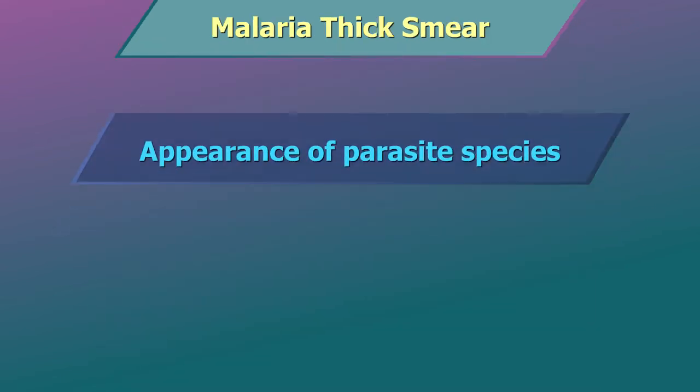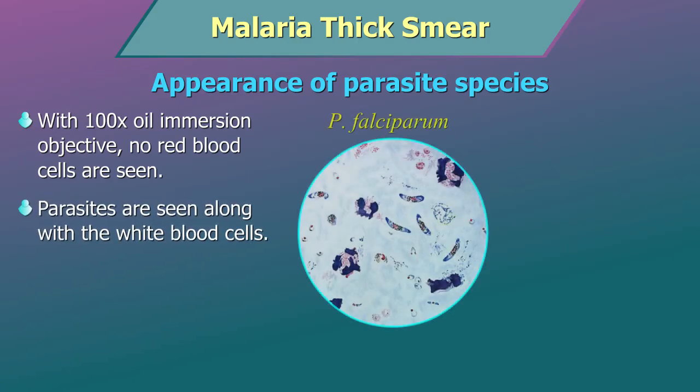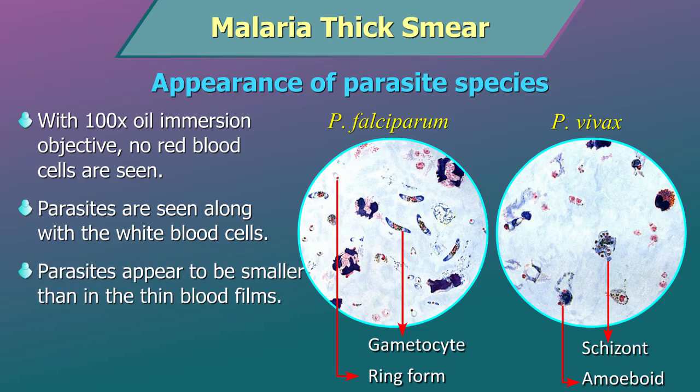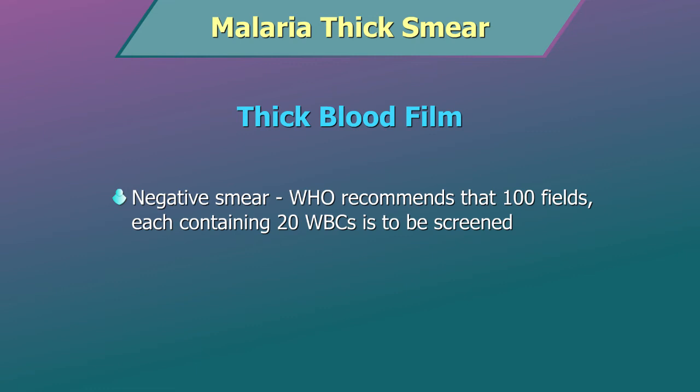Appearance of parasite species: in a thick blood film with 100x oil immersion objective, no red blood cells are seen. The malarial parasites are seen along with the white blood cells. However, the parasites appear to be smaller in the thick film than in the thin blood films. The fine rings of cytoplasm of the trophozoites may appear incomplete or broken in thick blood films. WHO recommends that at least 100 fields, each containing approximately 20 white blood cells, be screened before calling a thick smear negative.